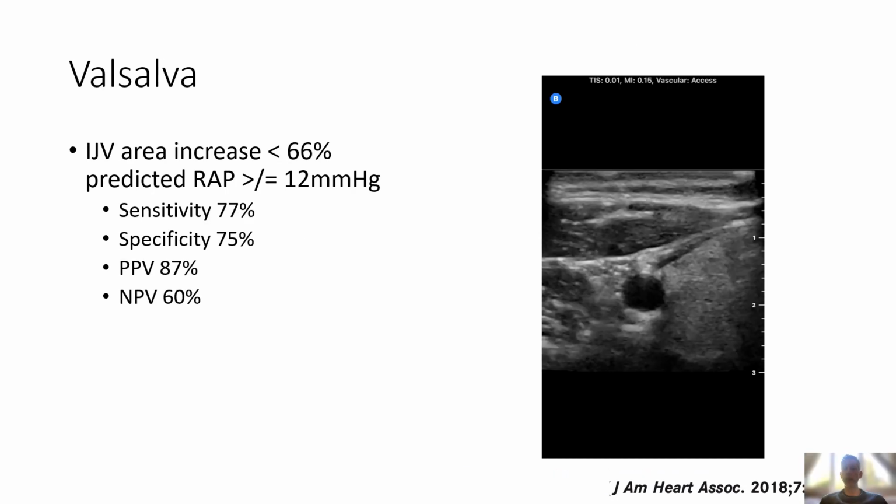Finally, I want to review the effect that Valsalva has on the internal jugular vein and its relationship with central venous pressure. I suggest this can be a helpful part of the internal jugular vein exam, especially in those with a pronounced forced expiratory phase when the column in the IJ is fluctuating over several centimeters. This is, of course, assuming that the forced expiratory effort is approximating the effects of Valsalva.